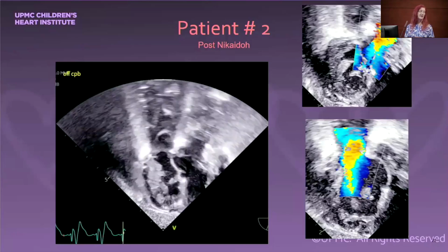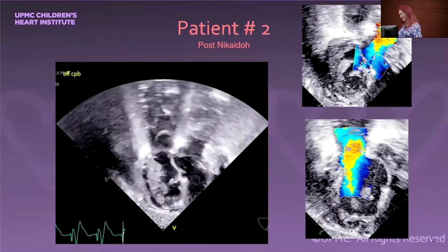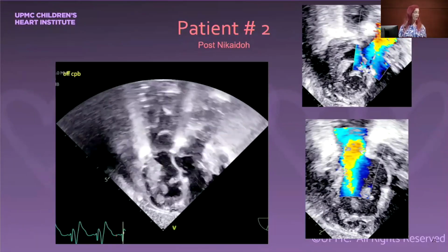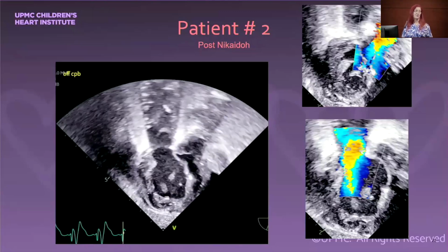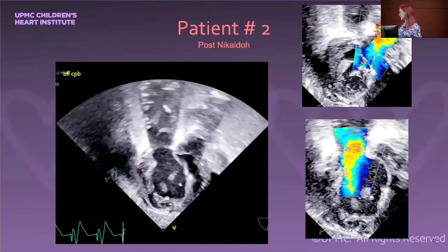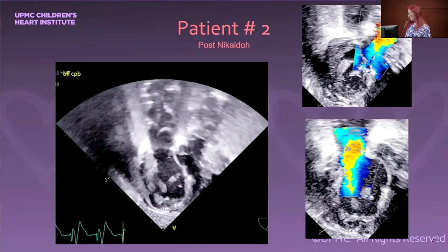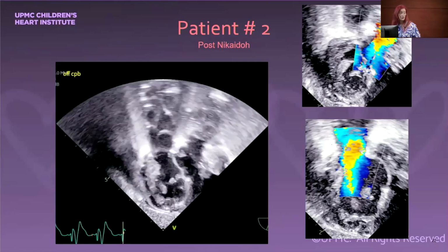I am a transthoracic echo person and TEE person. I do think that this is the area of multimodality. I think this is the area of 3D when it gets better, will be very helpful. But I will also give the caveat, because I have seen it, especially with one of my own patients, that there can still be subtle abnormalities in the OR that lead to a change in the surgical plan. But we do our best to try to get as much information to plan the surgical approach.